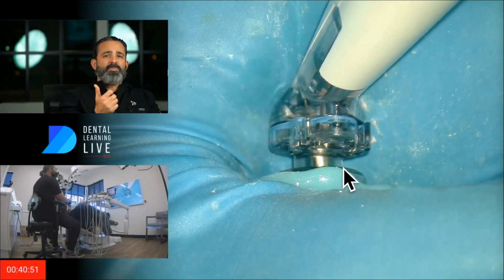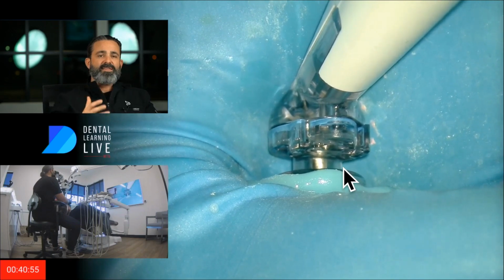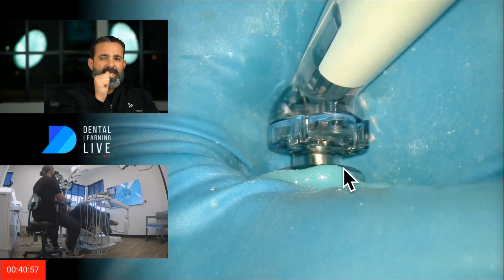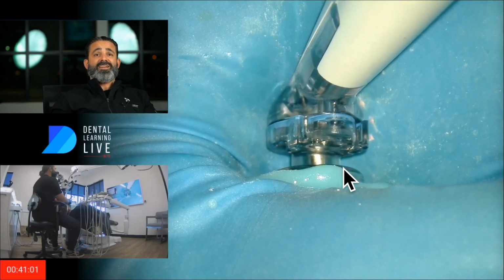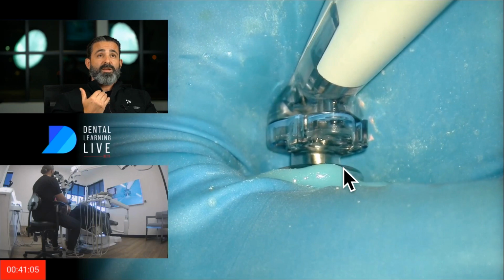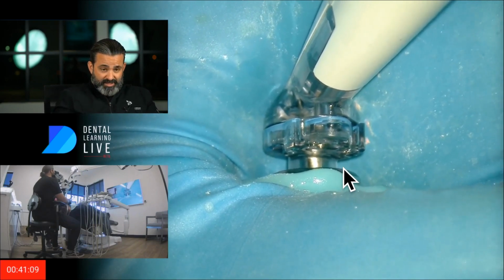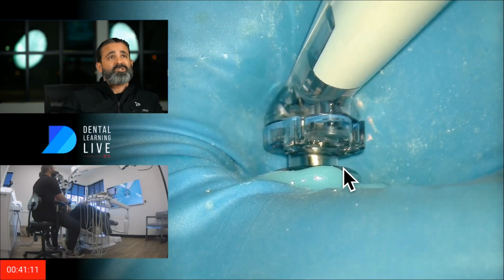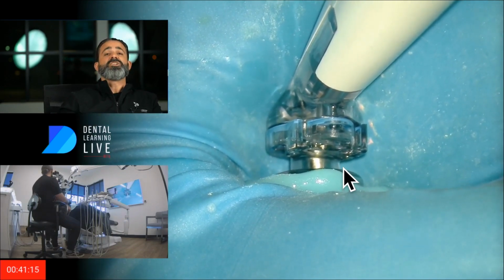And I think as a compensation for that, I'm getting more lighter-handed. I think when I started out, I was very heavy-handed with these things. And maxillary, that's fine to be heavy-handed because it just kind of lifts the patient's neck up. But if you're working on a mandible and you're heavy-handed so you don't worry about leaks, you're pushing the patient's chin down, which essentially closes their airway, or makes them swallow their own tongue. So don't do that. We want the chin lift, right?